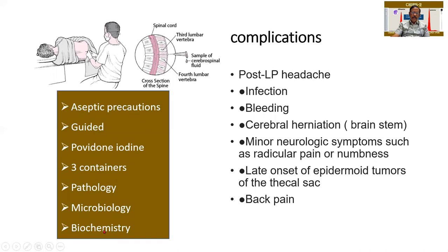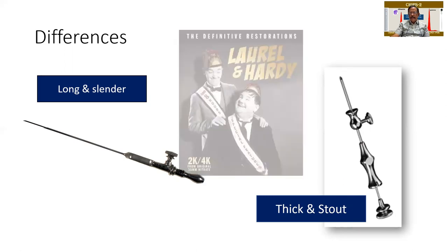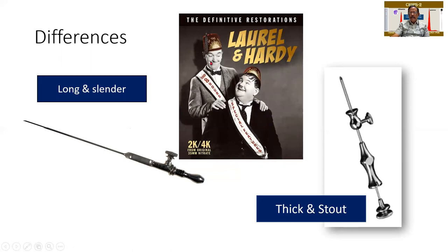These are the preparations we should have before doing a lumbar puncture. What are the differences between the needles? One is thin, long, and slender — in fact you can bend it because it passes through soft tissue; this is the lumbar puncture needle. Whereas another needle is thick, short, and stout — this is a bone marrow aspiration needle. Students generally mix up both. To remember: Laurel for lumbar puncture — he is tall, lean, and thin; and Hardy is short and stout. Please remember these two.